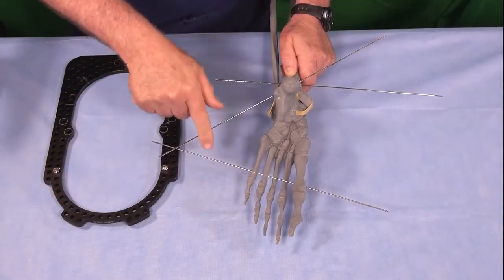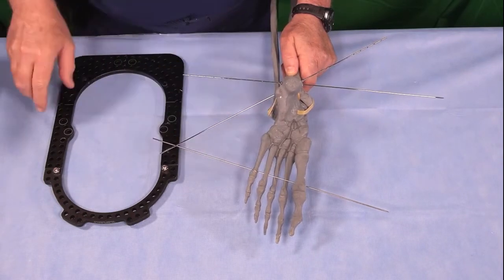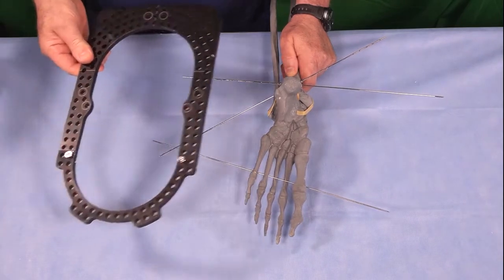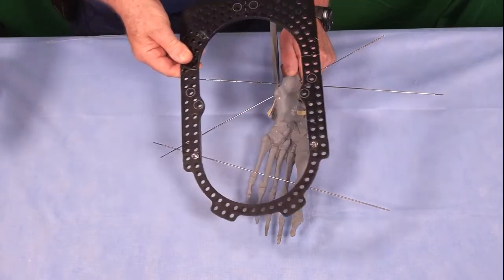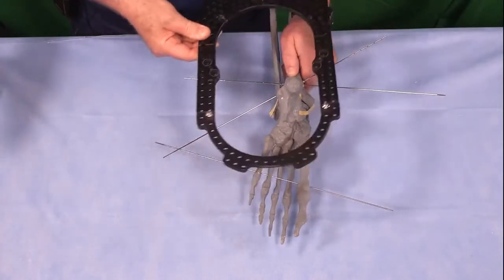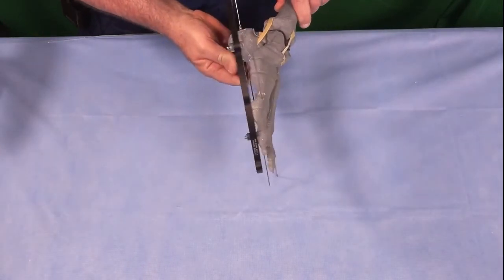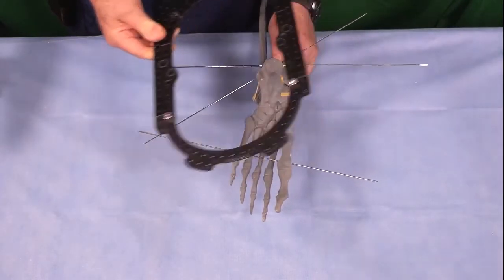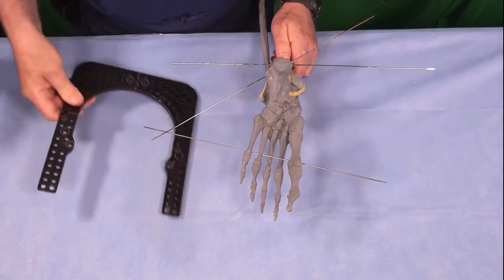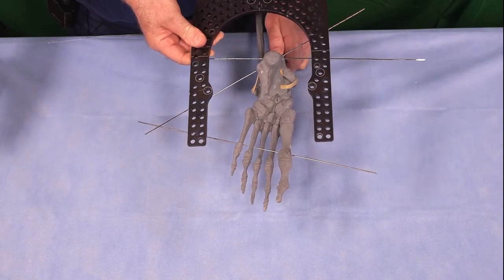I have my three basic wires, counteropposed olive wires in the heel and a smooth wire in the distal metatarsals. This is my foot ring, and I mentioned to you before that I don't like to construct the entire foot ring because it's hard to get it on over these wires. And I want this foot ring eventually to be parallel to the plantar surface of the foot. So a much easier technique is to take the open foot ring and then we'll add the half ring to close it after we slide this on.